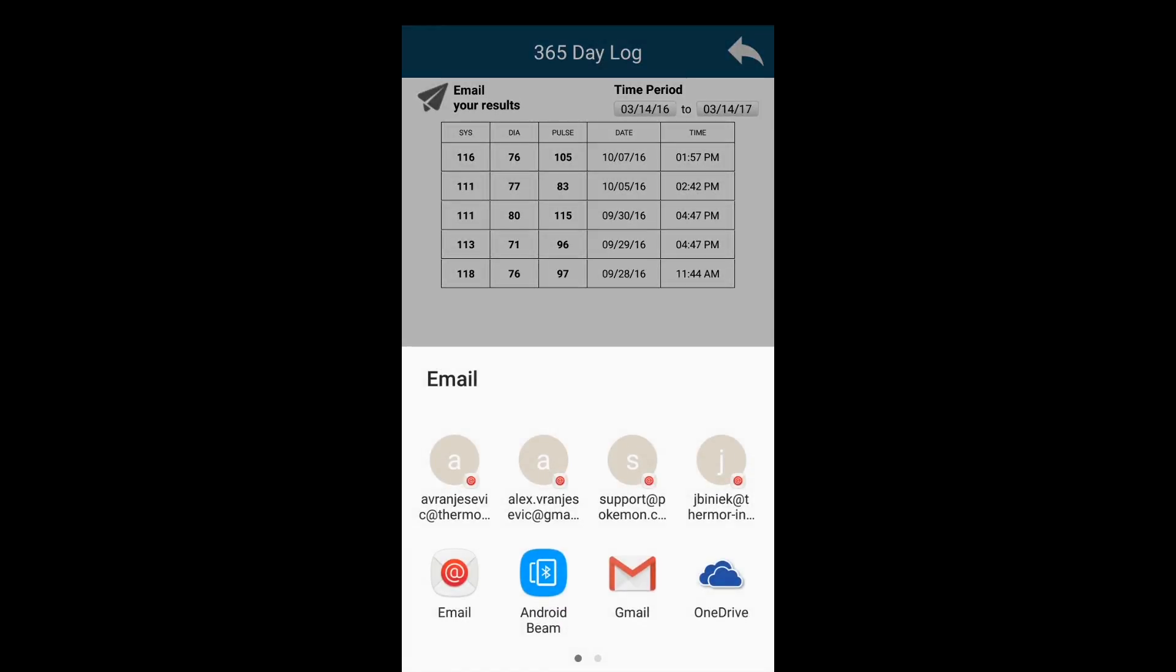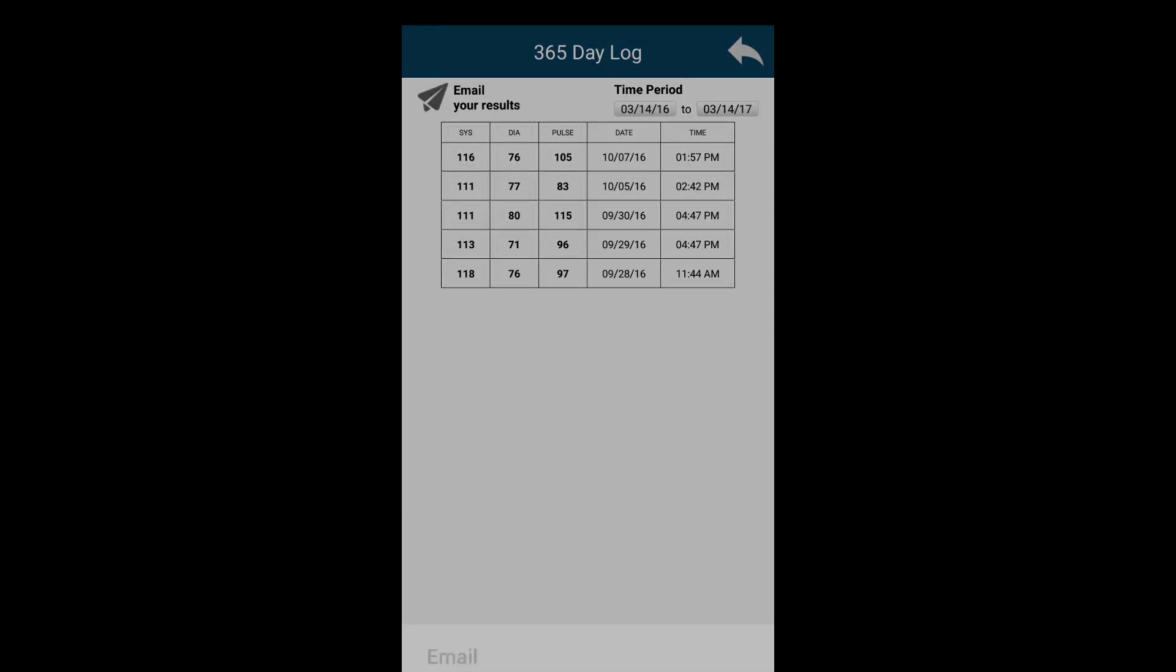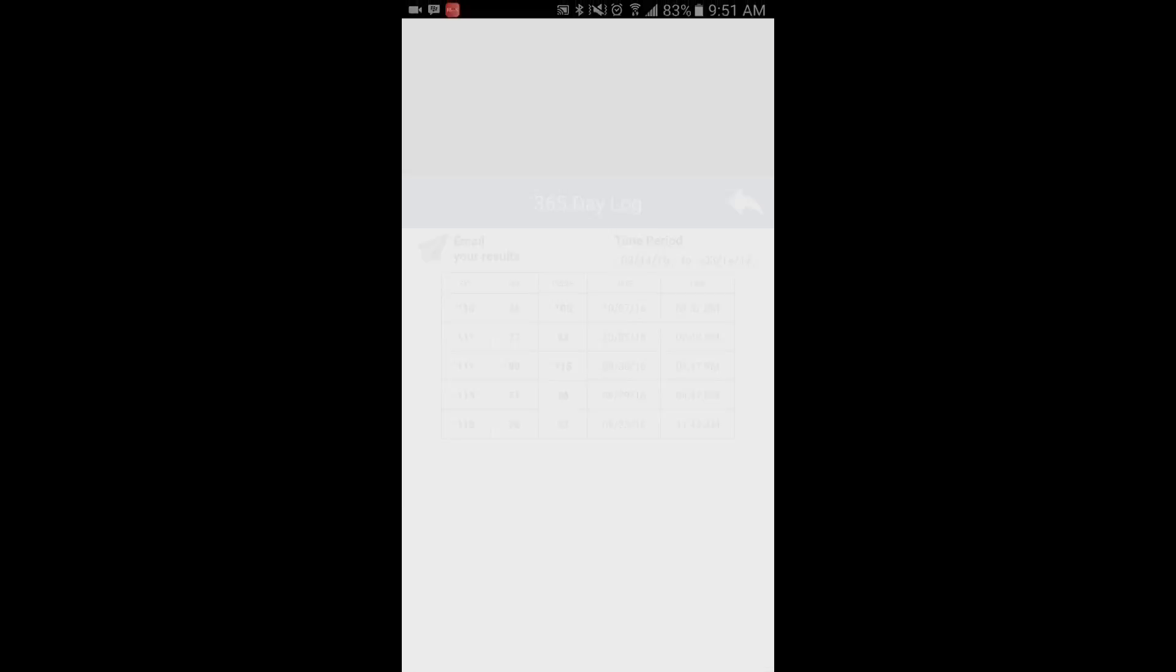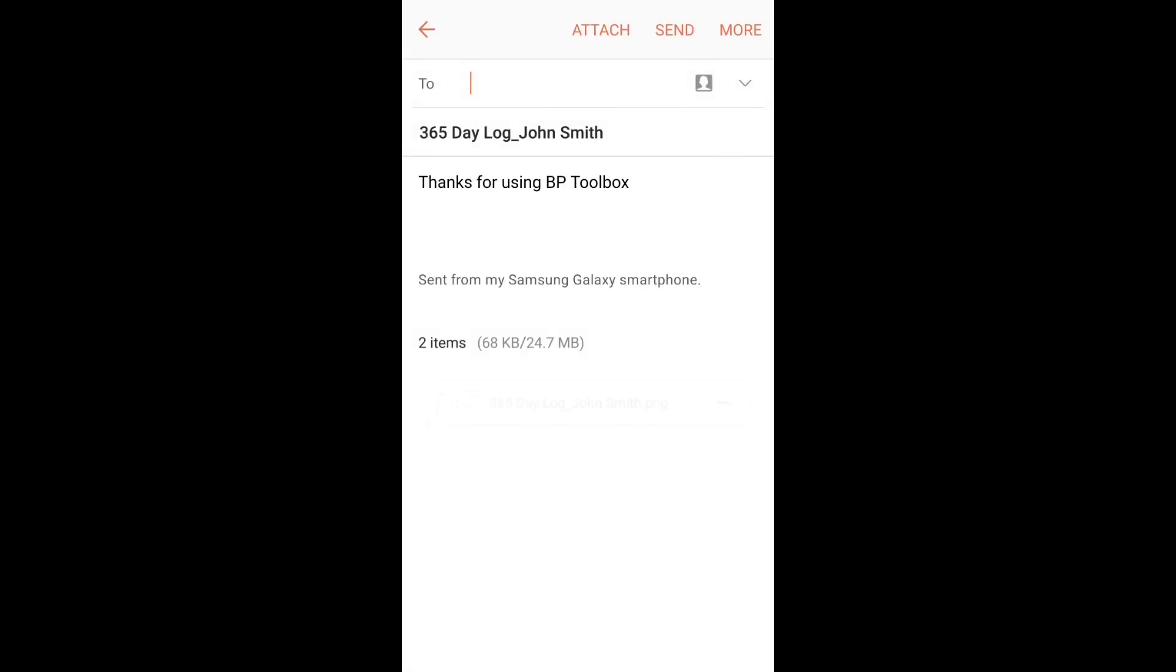With each option, you can email the results to yourself, your doctor, or even a family member.